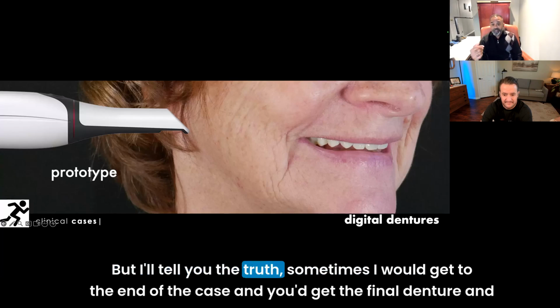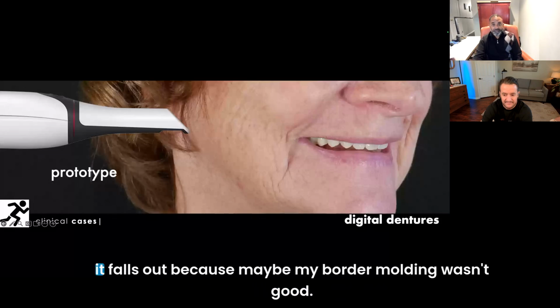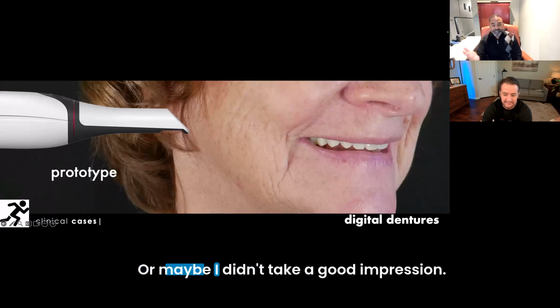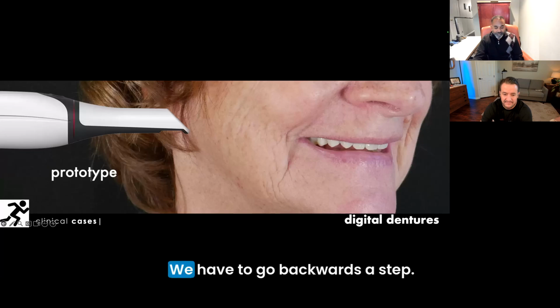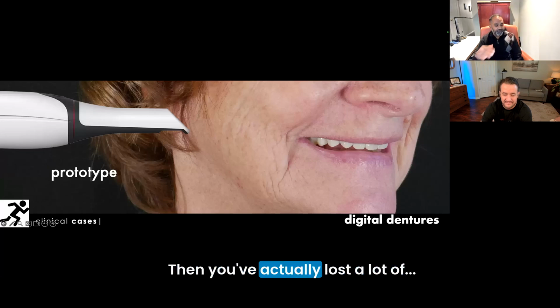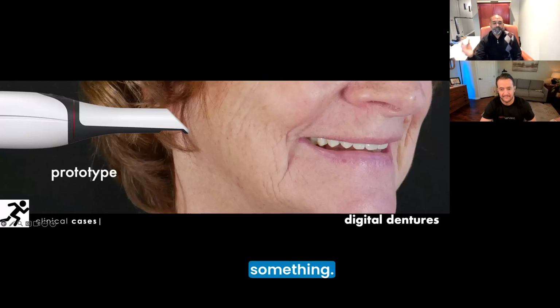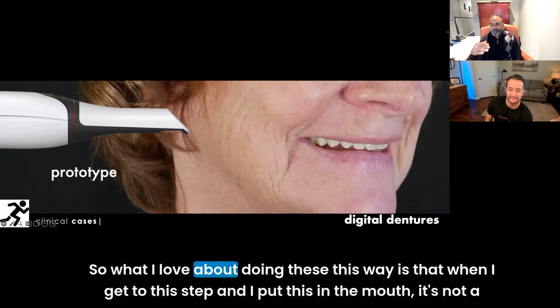But I'll tell you the truth, sometimes I would get to the end of a case and you get the final denture and it falls out because maybe my border molding wasn't good. Maybe we overextended somewhere, and that's stressful. Or maybe I didn't take a good impression. We have to go backwards a step. Then you've actually lost a lot of trust and capital with the patient, and now you're backpedaling, trying to fix something.